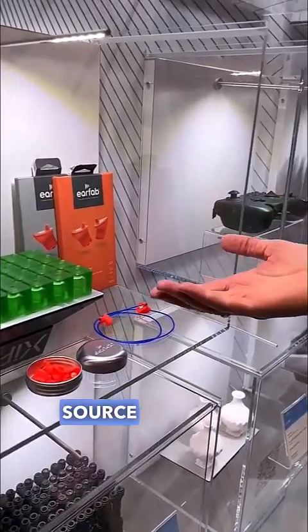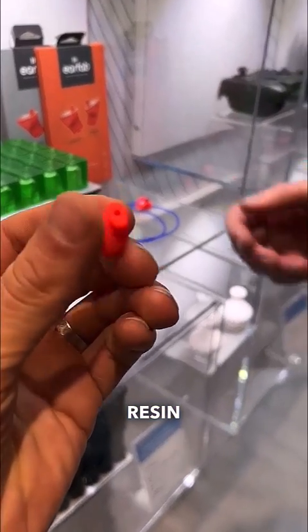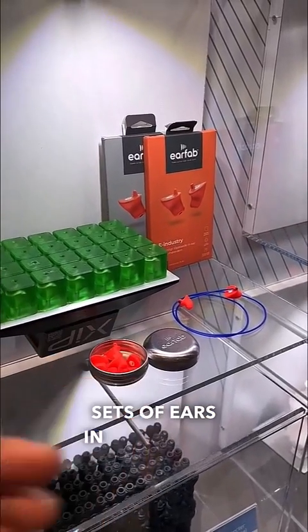So we were able to, on the Zip printers, using the open source platform, use our resin, which is a biodegradable, biocompatible resin. We were able to print 28 molds for 14 sets of ears in 44 minutes.